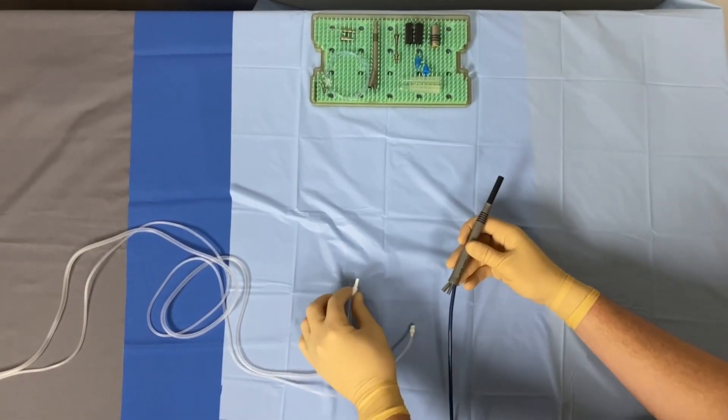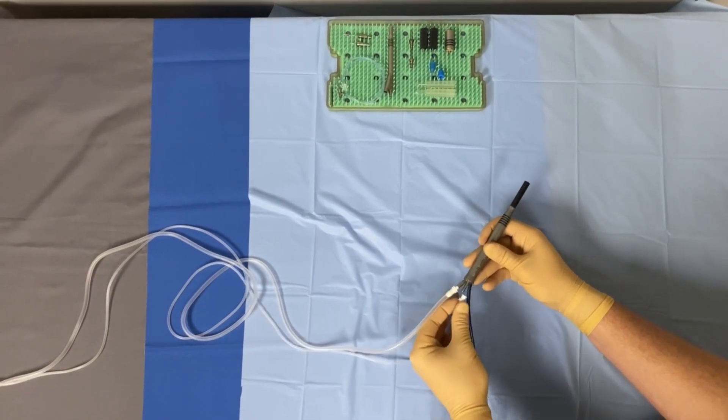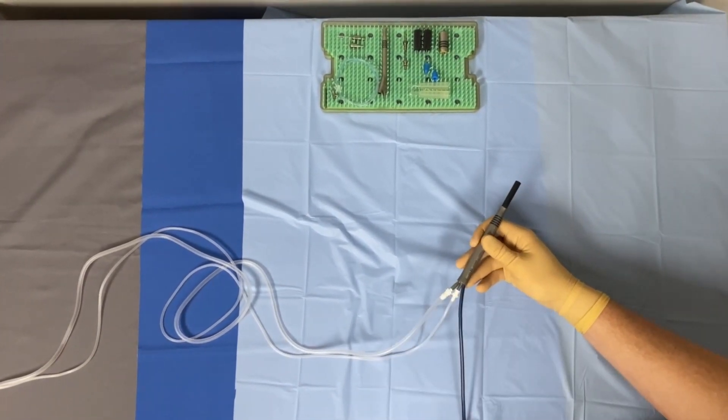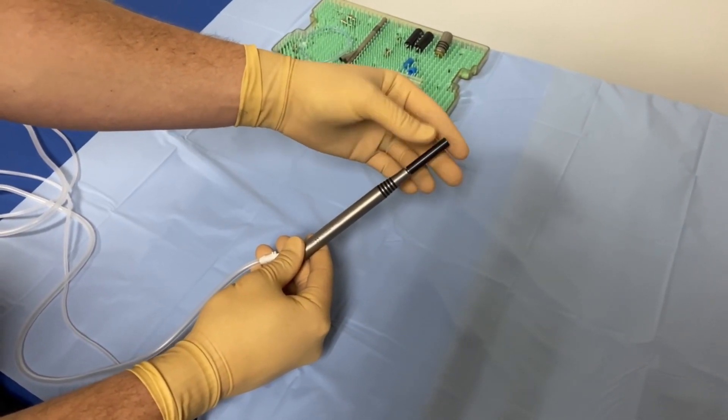Connect the irrigation and aspiration lines to the ports on the FACO handpiece. Make sure that the connections are secure. Unscrew the protective cap from the FACO handpiece.